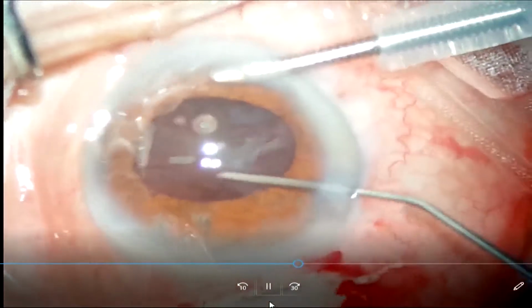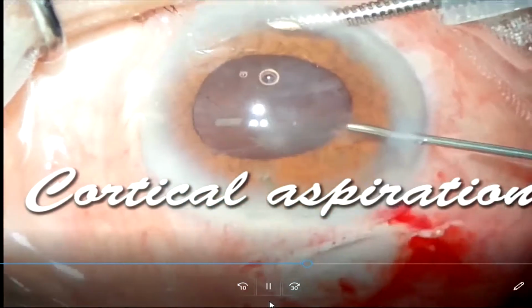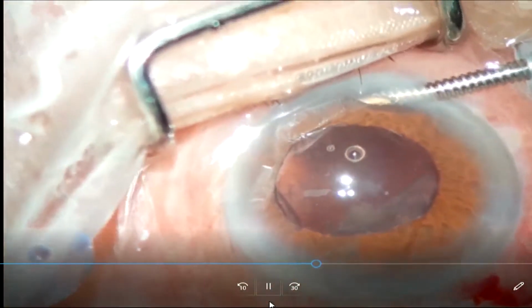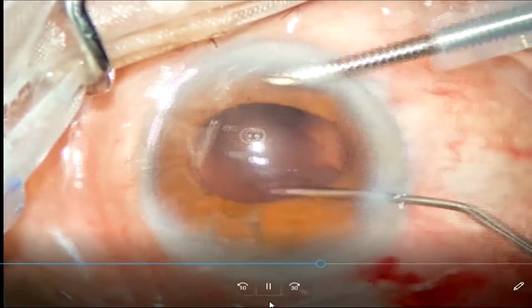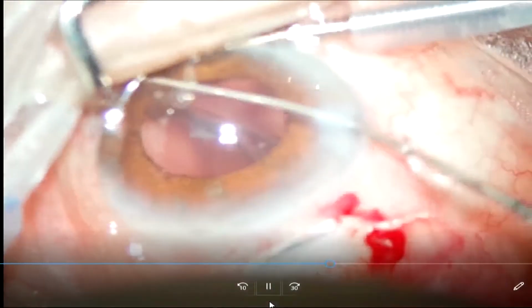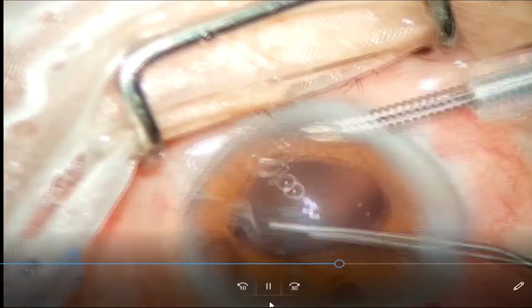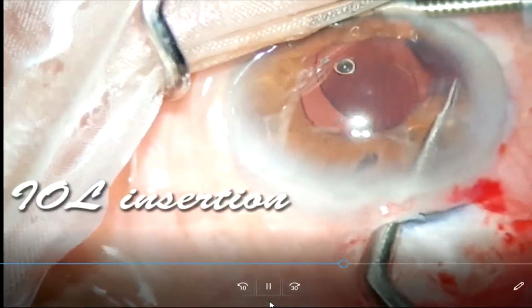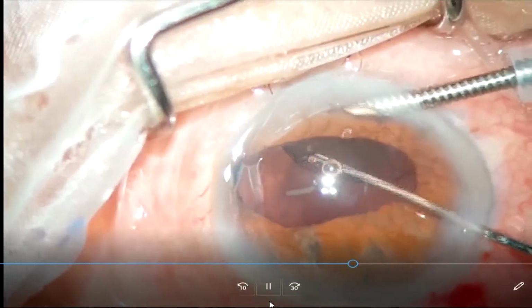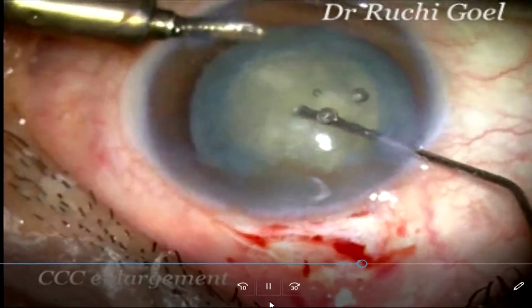Now once the nucleus is out, I don't use a Simcoe cannula, I just use the same cannula that you use for hydrodissection, through the side port with the anterior chamber maintainer on, and aspirate the cortex. This is especially useful for aspirating the 12 o'clock cortex. You can see how easily, without any injury to the posterior capsule, you can go quite behind. And there is no chance of collapse of the chamber. You can put the IOL either under fluid or under visco. Nowadays I prefer to do it under fluid only with ACM on.